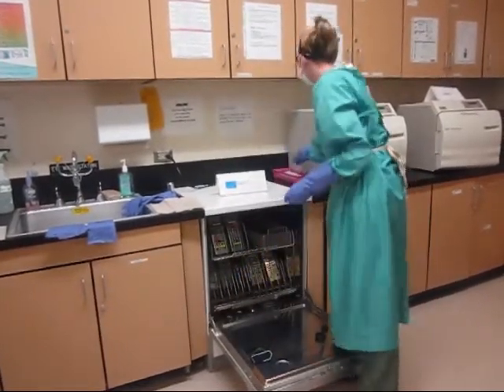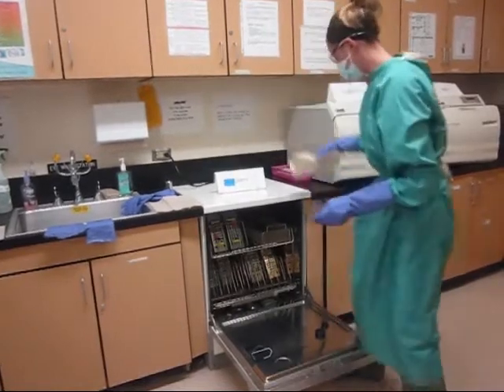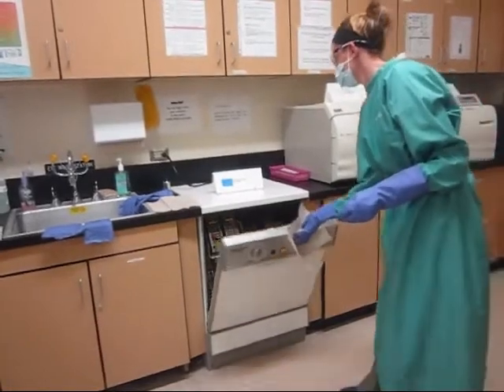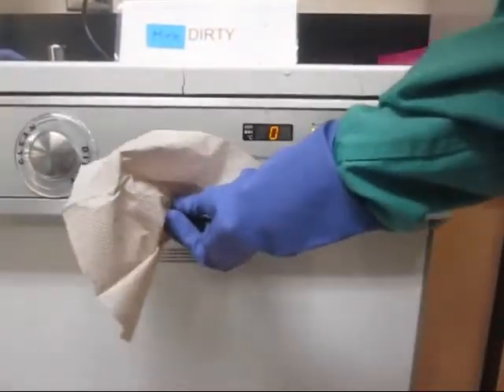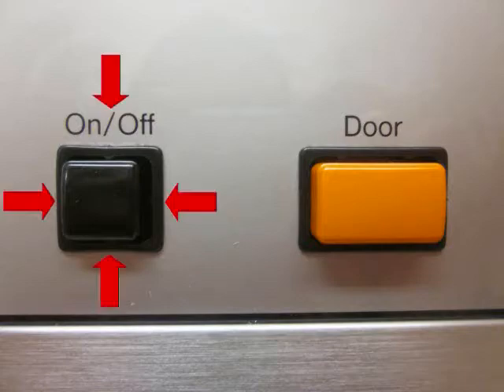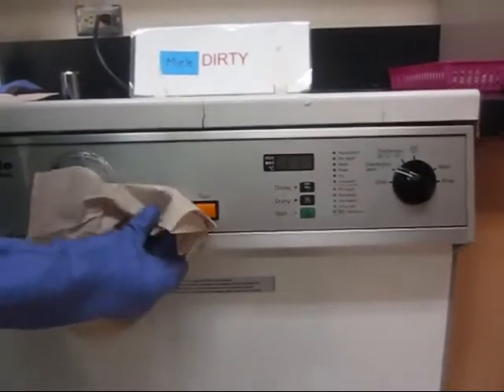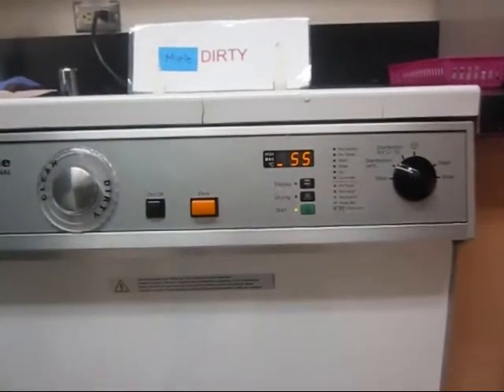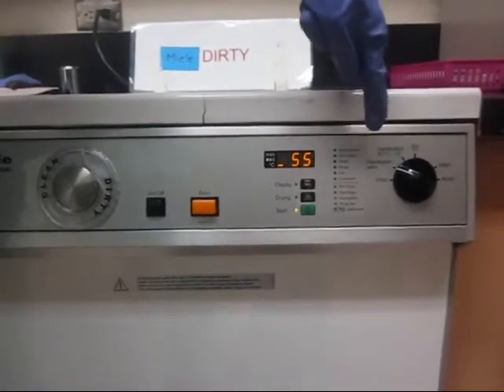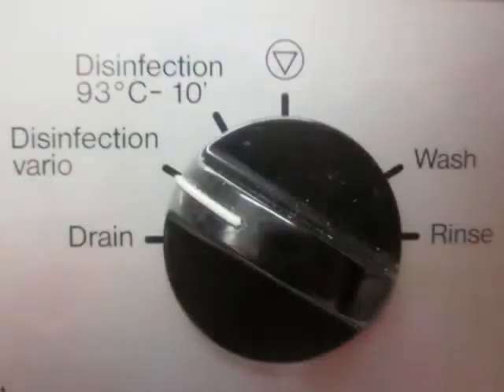Once the Miele is loaded, Nadine closes the door carefully using a paper towel. Slamming the door may damage the delicate door panel fuse. Please note the dirty sign. The Miele needs to be turned on — make sure the door is secure or the Miele will leak. Nadine selects disinfection vario for stainless steel instruments and protein soils.